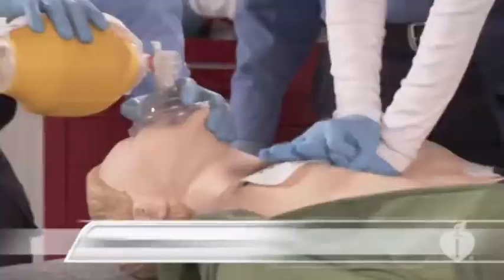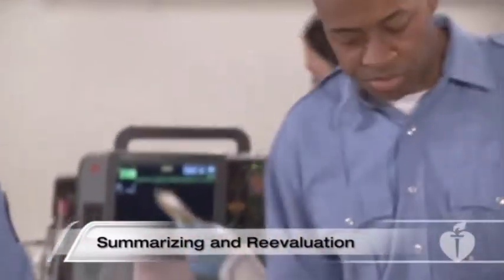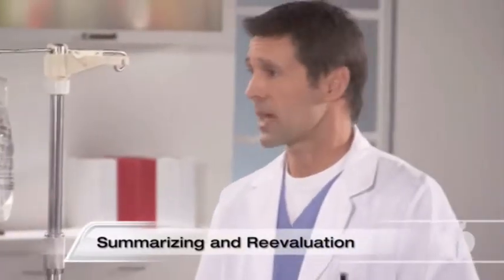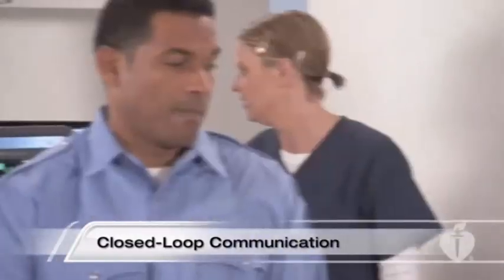2 minutes. Okay, let's analyze. Switch roles. Okay, the patient remains in VFib. The protocol for this biphasic device is escalated dosing. Let's shock again at 300 joules. Shocking at 300 joules.